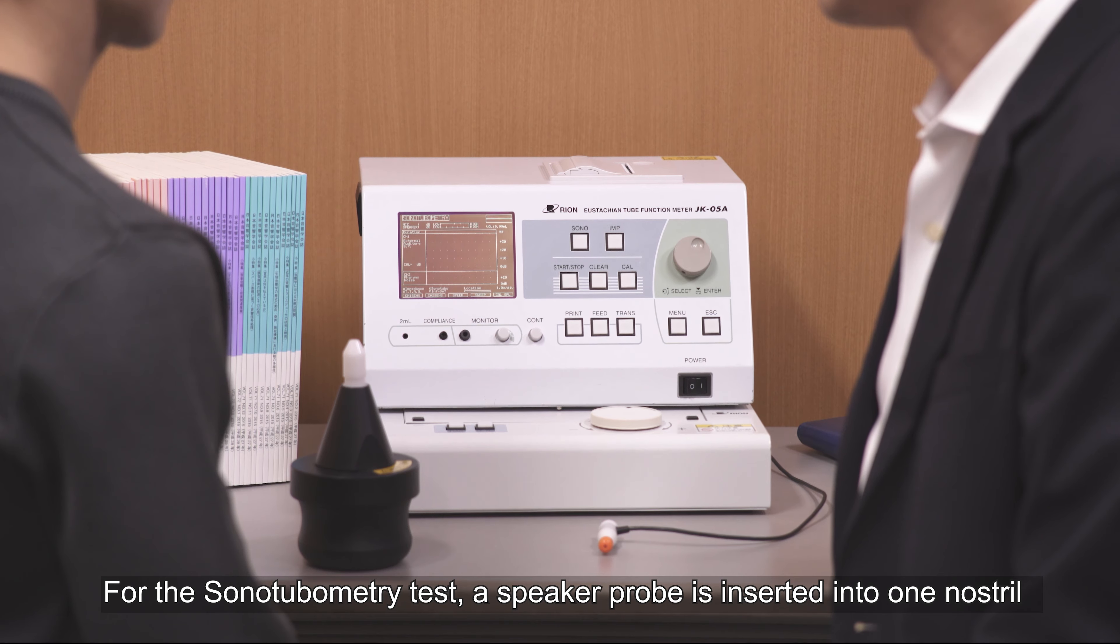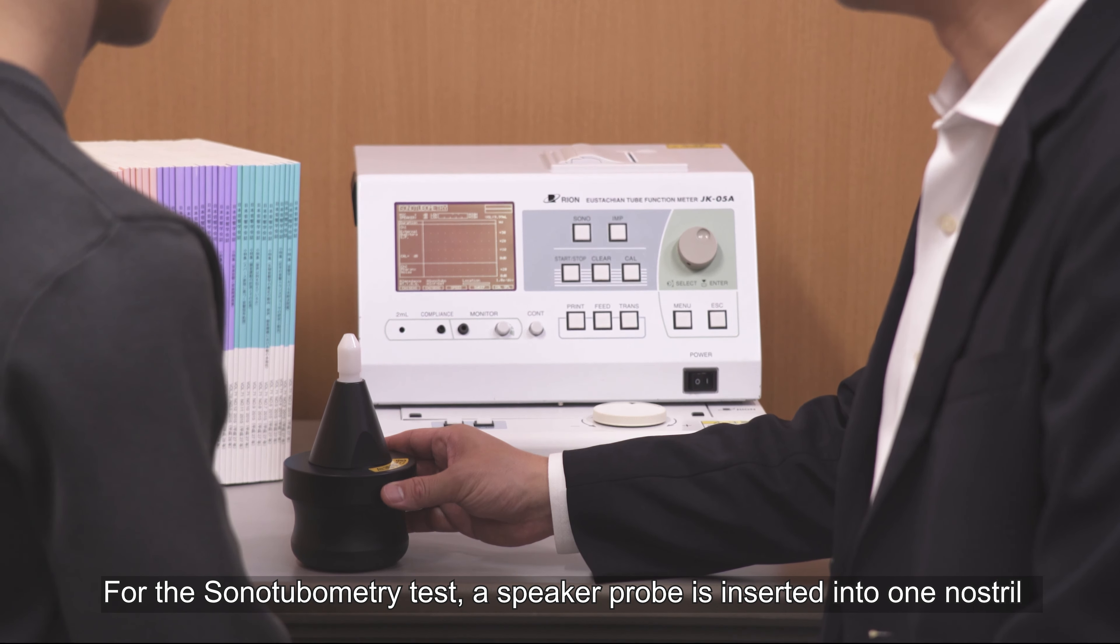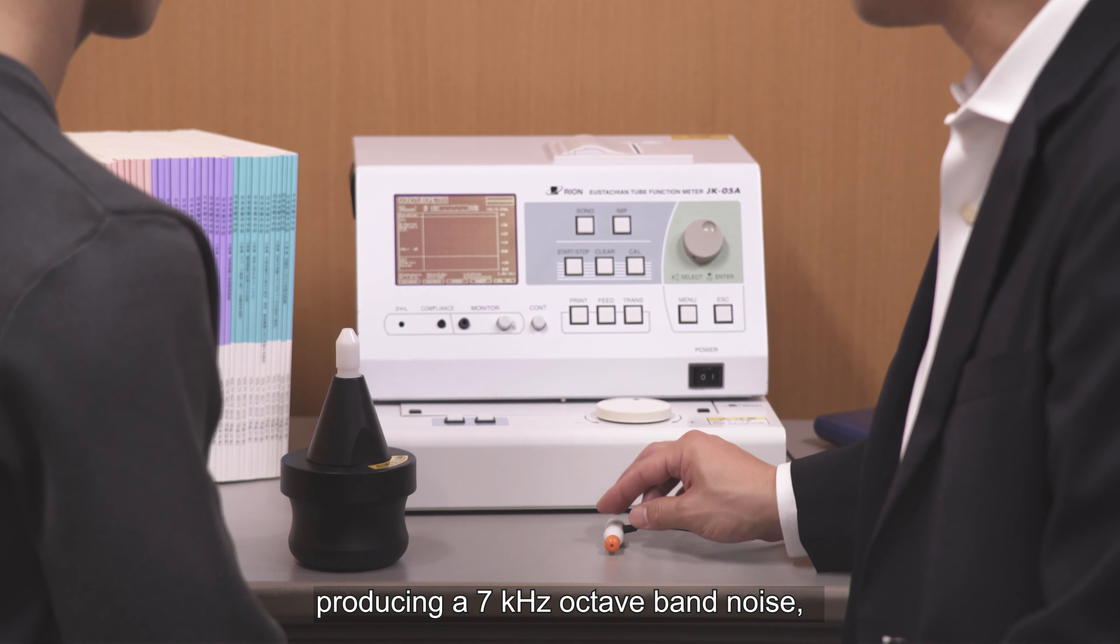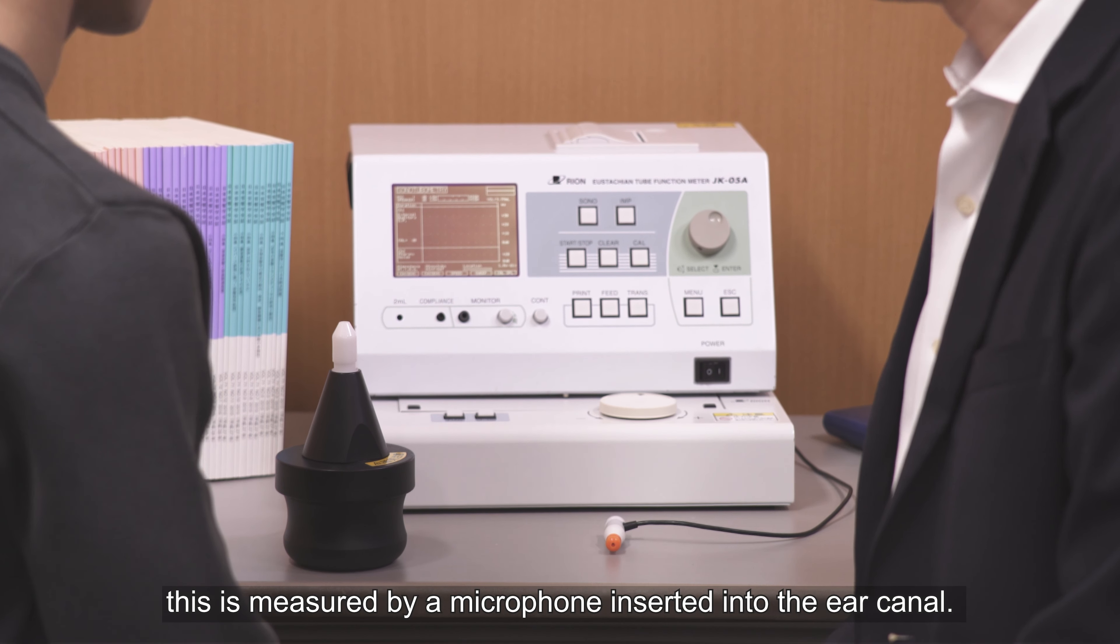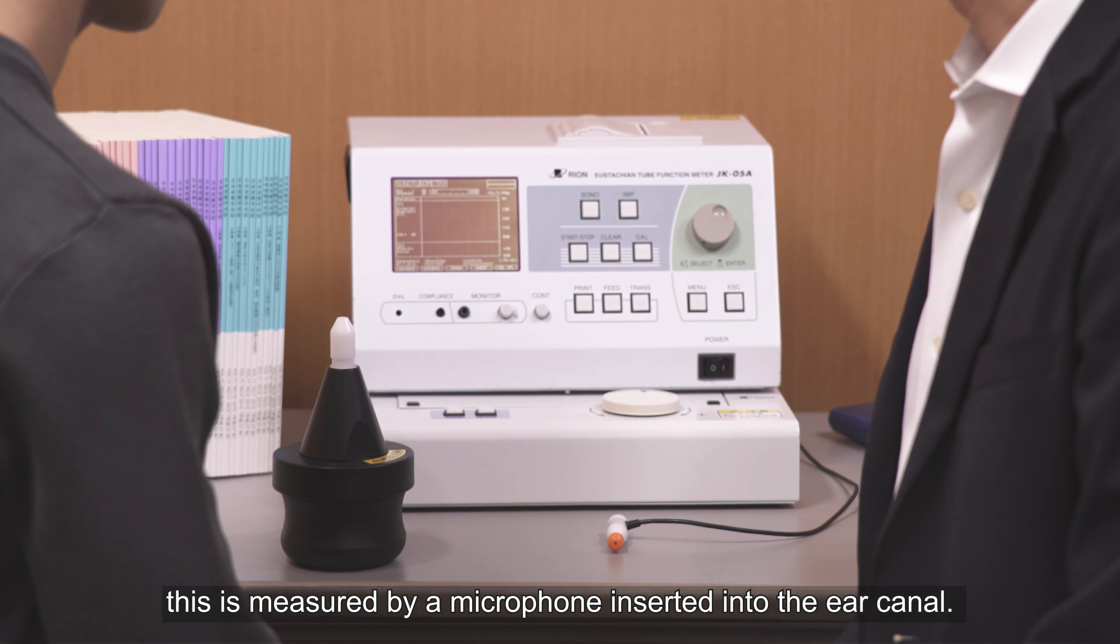For the sonotubometry test, a speaker probe is inserted into one nostril, producing a 7kHz octave band noise. This is measured by a microphone inserted into the ear canal.